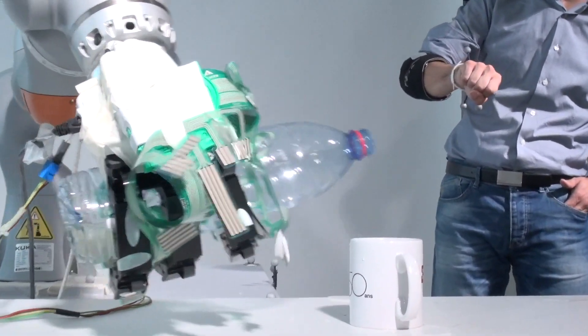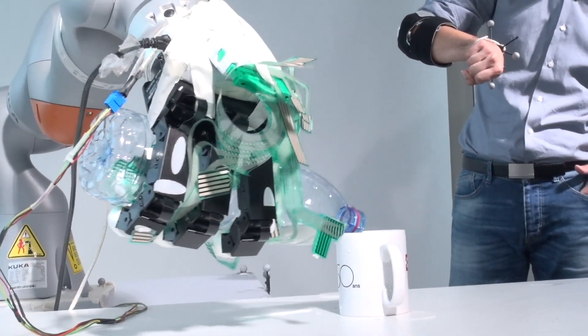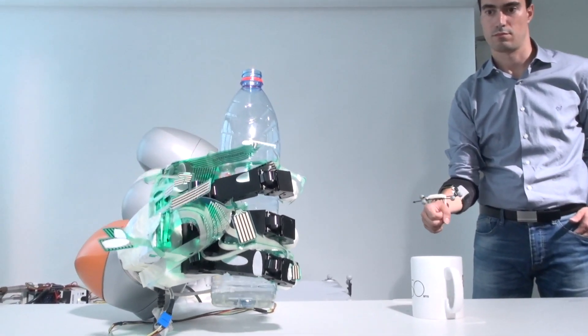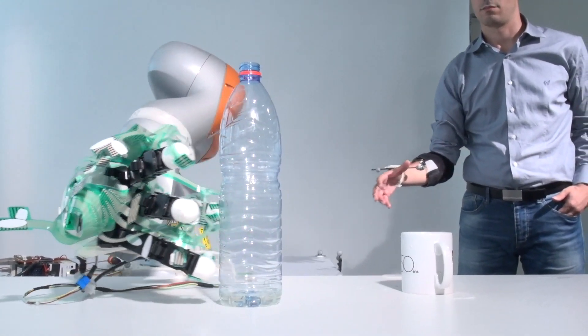What we're doing is developing a very smart prosthetic hand that allows an amputee to control each finger individually and also benefit from the aid of robotic assistants to grasp easier. Our research is a really good example of shared control, which is a concept we're very excited about in the field of robotics — that is, merging user intention with robotic automation.